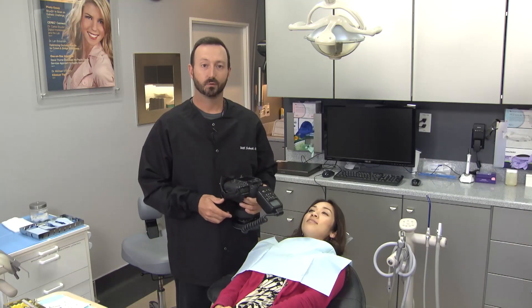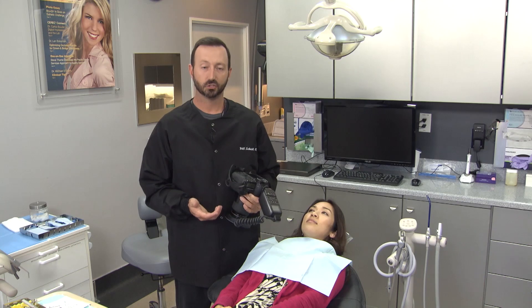To start off, I'm going to take some photographs of tooth number 30 without reflection or retraction to show you the difference.